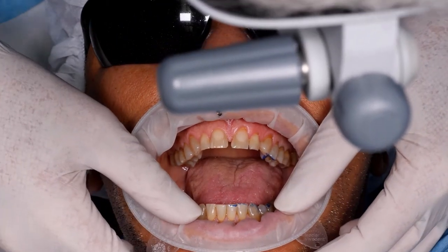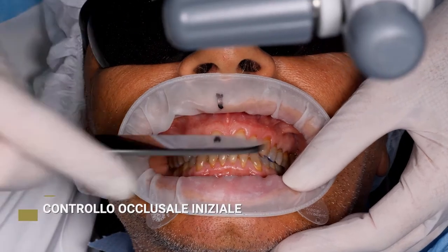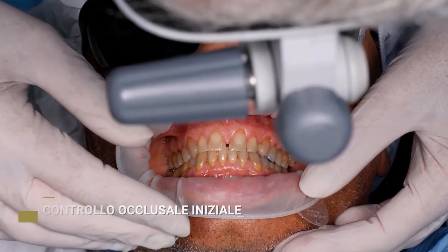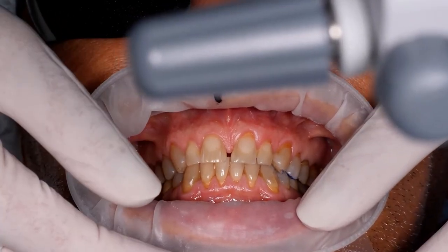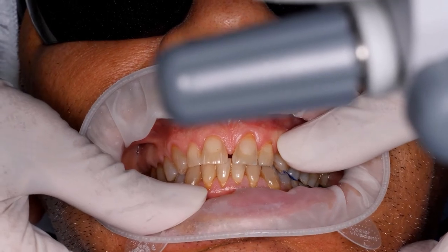We are now evaluating lateral excursions here in practice. We have minimal space in the medial part of the left cuspid, so we might have opted for a full veneer. However, the space at the lingual level is limited, so we'll have to go for substantial preparation. And I don't want to be aggressive.